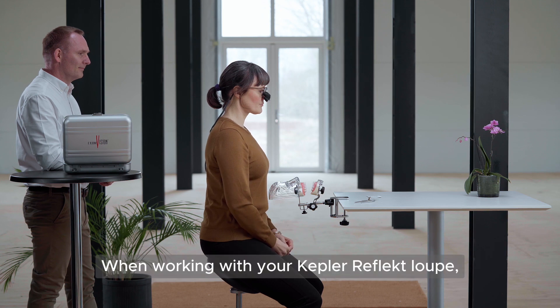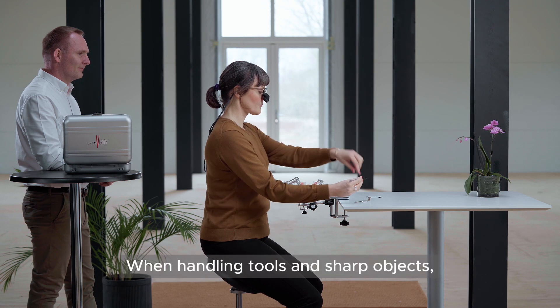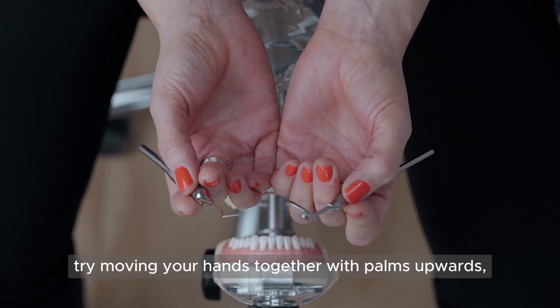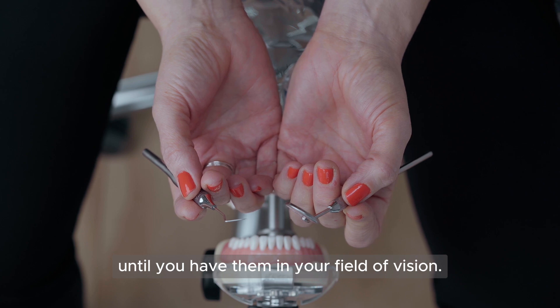When working with your Kepler Reflekt loupe, remember to practice your hand-eye coordination. When handling tools and sharp objects to begin with, try moving your hands together with palms upwards, until you have them in your field of vision.